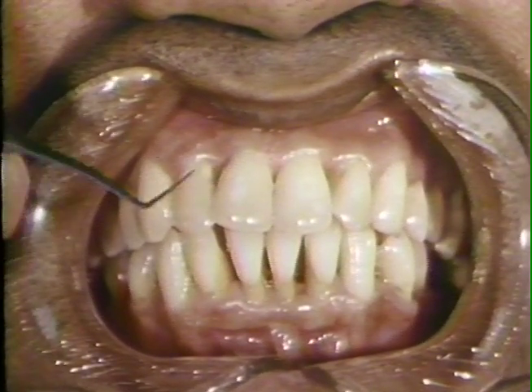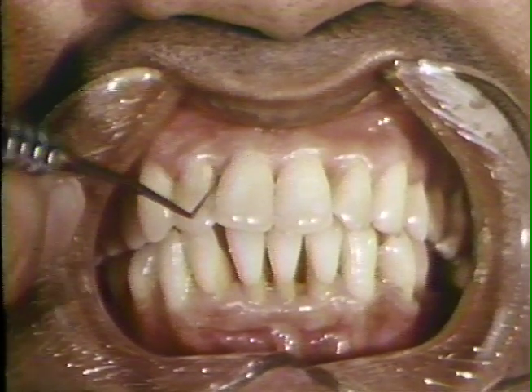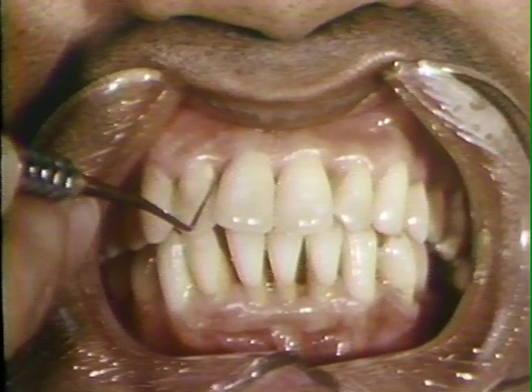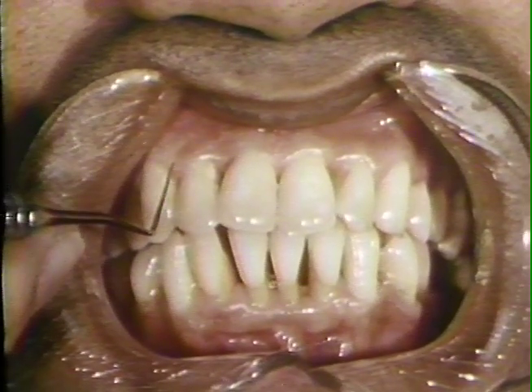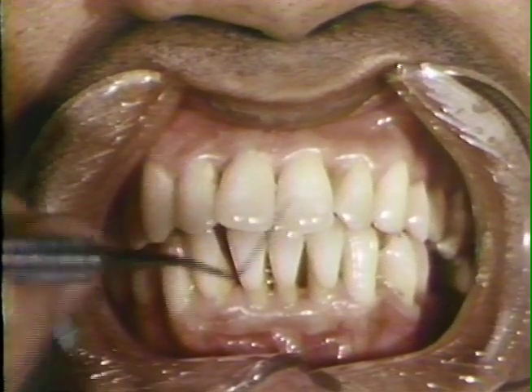When the patient is recalled following the completion of the scaling, root planing, polishing, and instruction in oral hygiene, his gingival tissues are re-examined. Note that there is no gingival bleeding from probing, and the gingival tissues have become much more firm and dense. This improvement applies both to the free and attached gingiva.